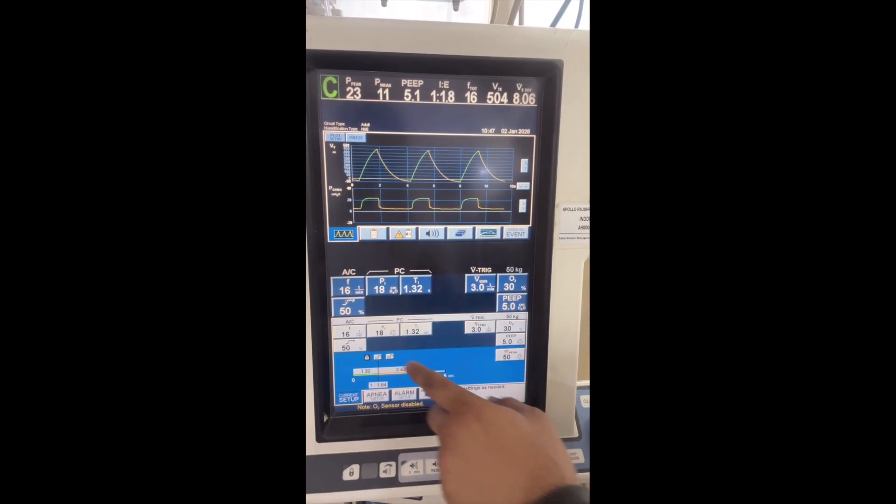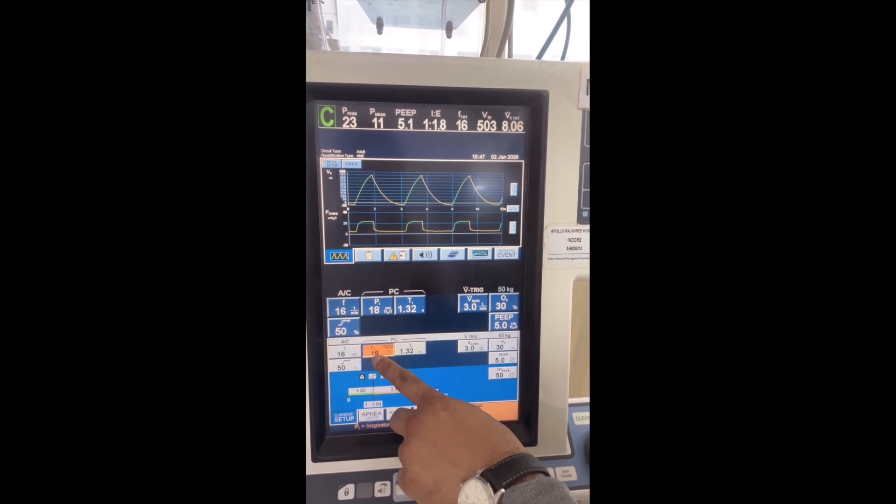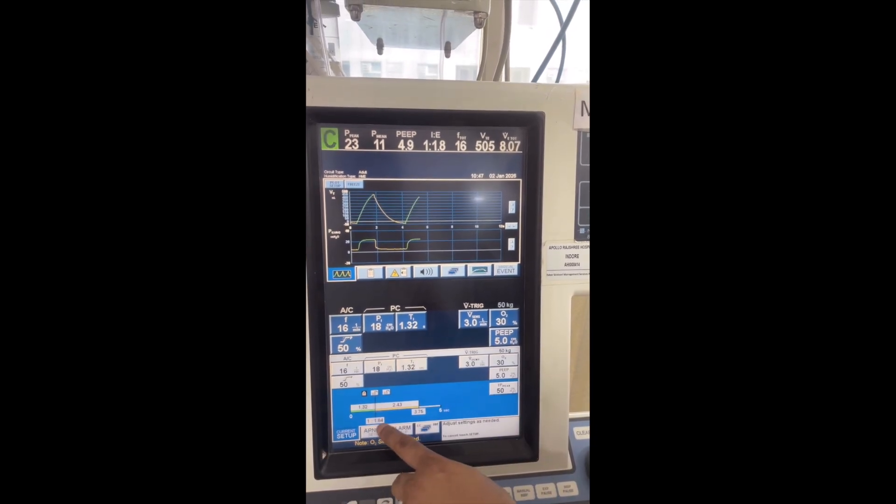Let's see here. As of now it is pressure control. In pressure control, you set the respiratory rate, the inspiratory pressure, and the I:E ratio - this much is the inspiratory time.